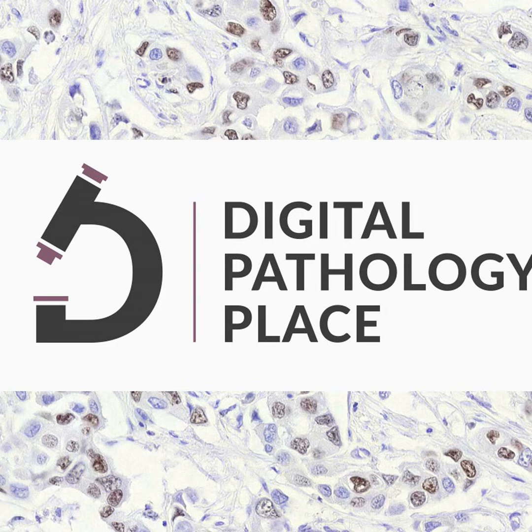I remember the story of Immunoscore, where they were measuring, was it CD8 and CD3, the cytotoxic T cells that were close to that tumor margin. Exactly. Right. So that's already something you cannot do visually, and it ended up being an image analysis driven score for colorectal cancer prognosis. So.